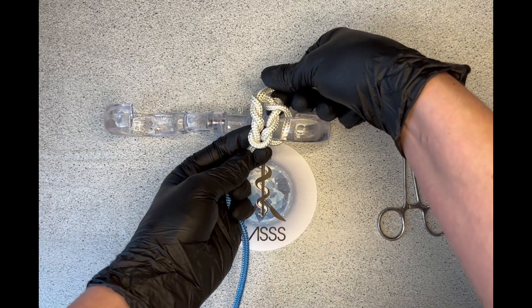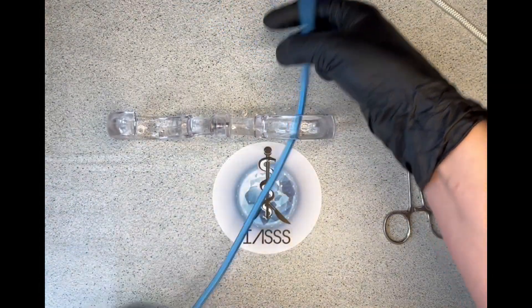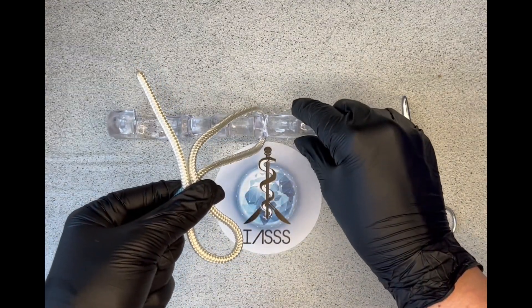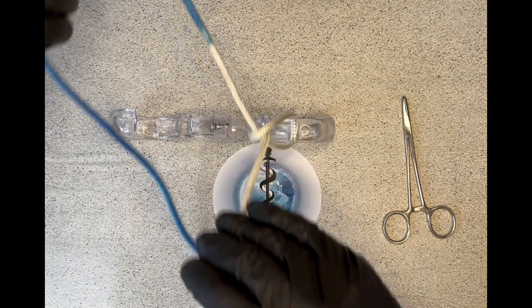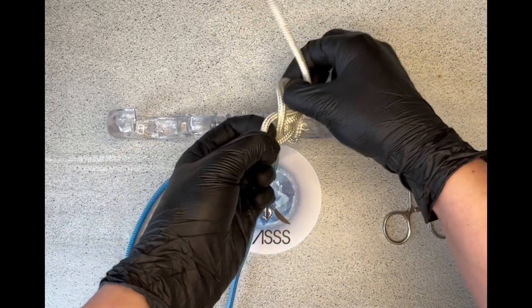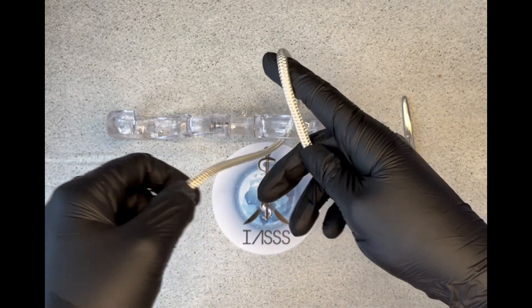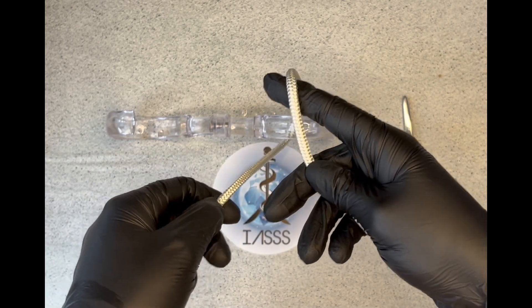So that's reef knot, slip knot and surgeon's knot on the hand tie. What you might notice when practicing is that you tie knots quite up in the air — keep an eye on the tissue. When you tie in the air and pull on your suturing material a lot, you're actually creating tension up in the air and moving your tissue, not working gently with it. You want to tie gently so that you direct your suture down to where you want it without creating tension — you don't want to accidentally pull the suture out of the tissue or injure the tissue further.